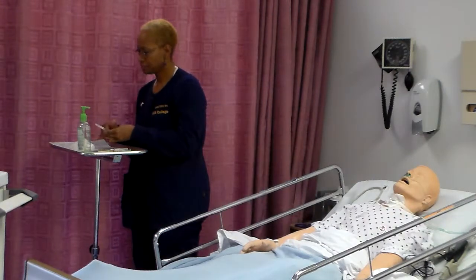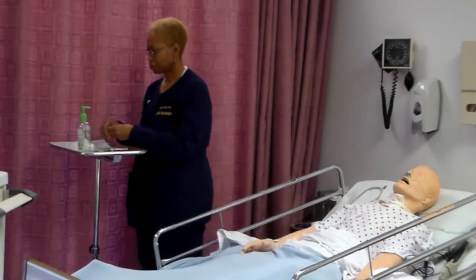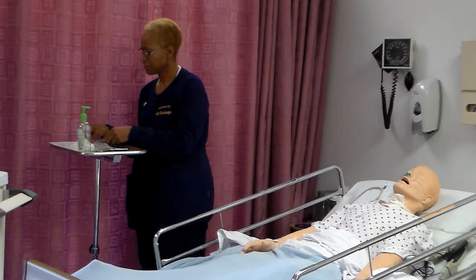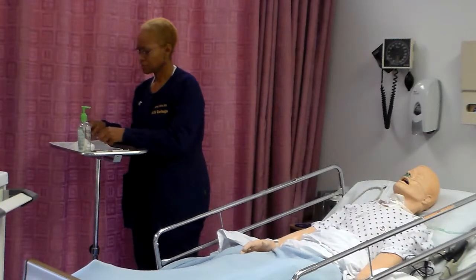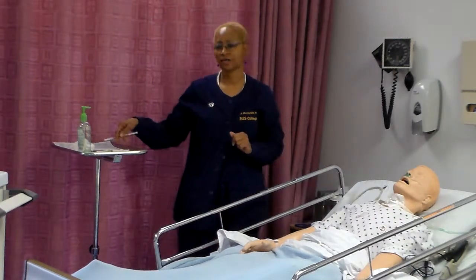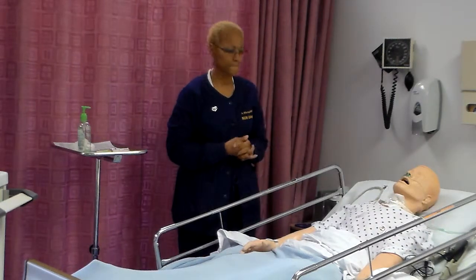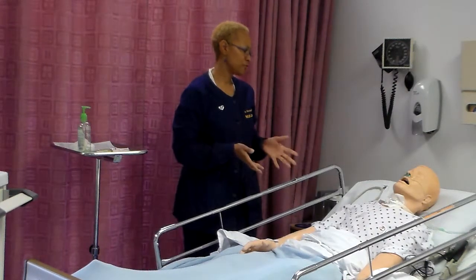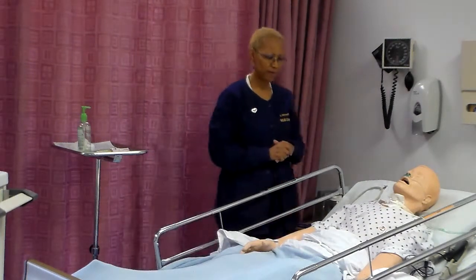Okay, you check the amount. You check the time. You go to your next medication. Okay, you have the amount, the time, the medication, and then your third medication. Again, making sure you educate your client on each med. Explain steps of procedure and tell client injection may cause a slight burning or may sting. Hey, Mr. Johnson, you said you've received your injections before. He said, oh yeah, I have this all the time. I'm aware.